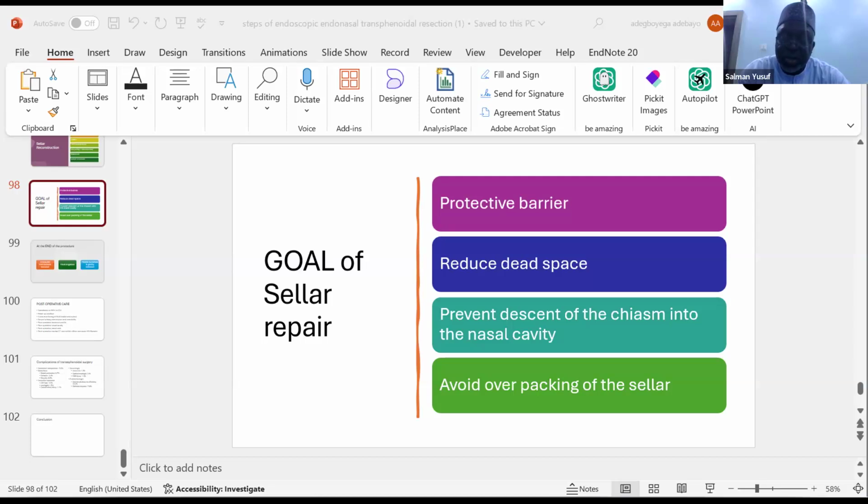Traditionally, neurosurgeons are trained with the microscope, and the evolution of the endoscope has been presented. Actually, it's a technique borrowed from our ENT colleagues, especially the endonasal approach, and in some centers the procedure is done in conjunction with the ENT surgeon.